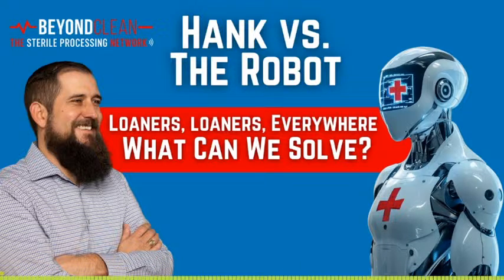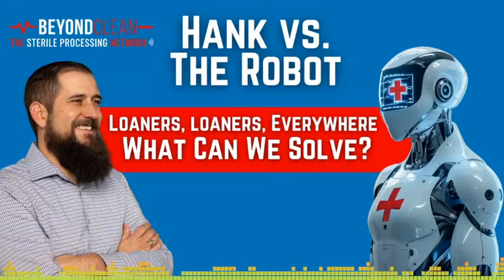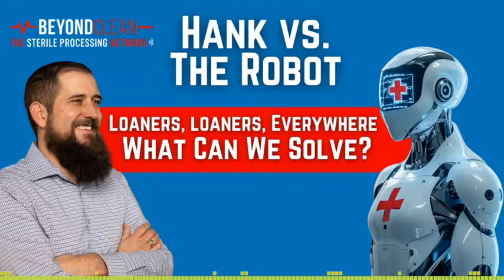First up, we've got Stryker. They're a giant in orthopedics, covering everything from joint replacement to trauma and spine solutions. Their loaner sets are common, especially for things like knee and hip replacements. Next, Zimmer Biomet is another heavyweight. They specialize in joint reconstruction, spine, and sports medicine. You'll see a lot of their loaners for orthopedic trauma cases and reconstructive surgeries.